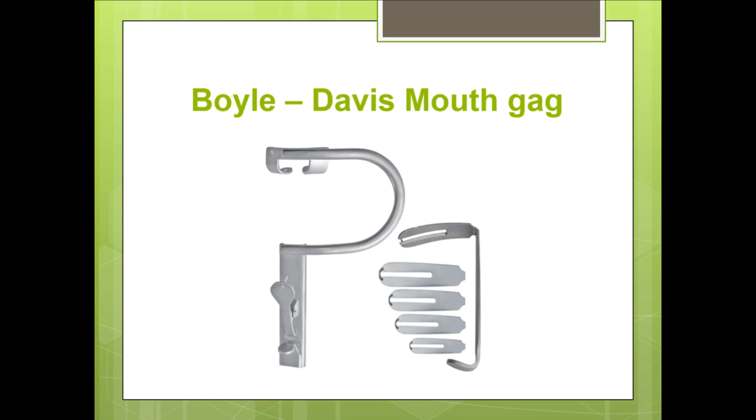So this is the Boyle-Davis mouth gag with different sizes of the tongue blades. So depending upon the age of the patient and size of the oral cavity, we should select the proper size tongue blade. Okay, this is the Boyle-Davis mouth gag.